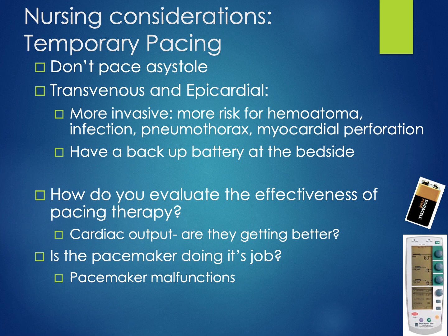Let's talk about some of the key considerations with pacers in general. So first, a key point to make here is pacing is only used for symptomatic bradycardias, not asystole. If you think back to your lethal dysrhythmias, a patient with asystole is dead. They need CPR and epinephrine, not pacing. There is no underlying rhythm to pace.